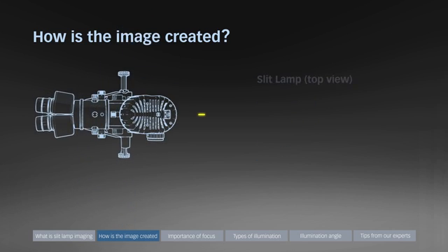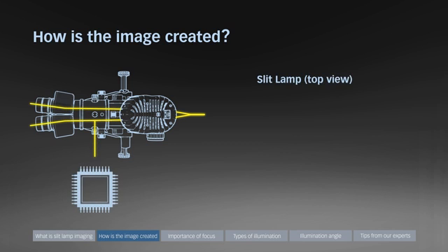The camera captures the image of only one light path. Always keep in mind on which side your camera captures the images.